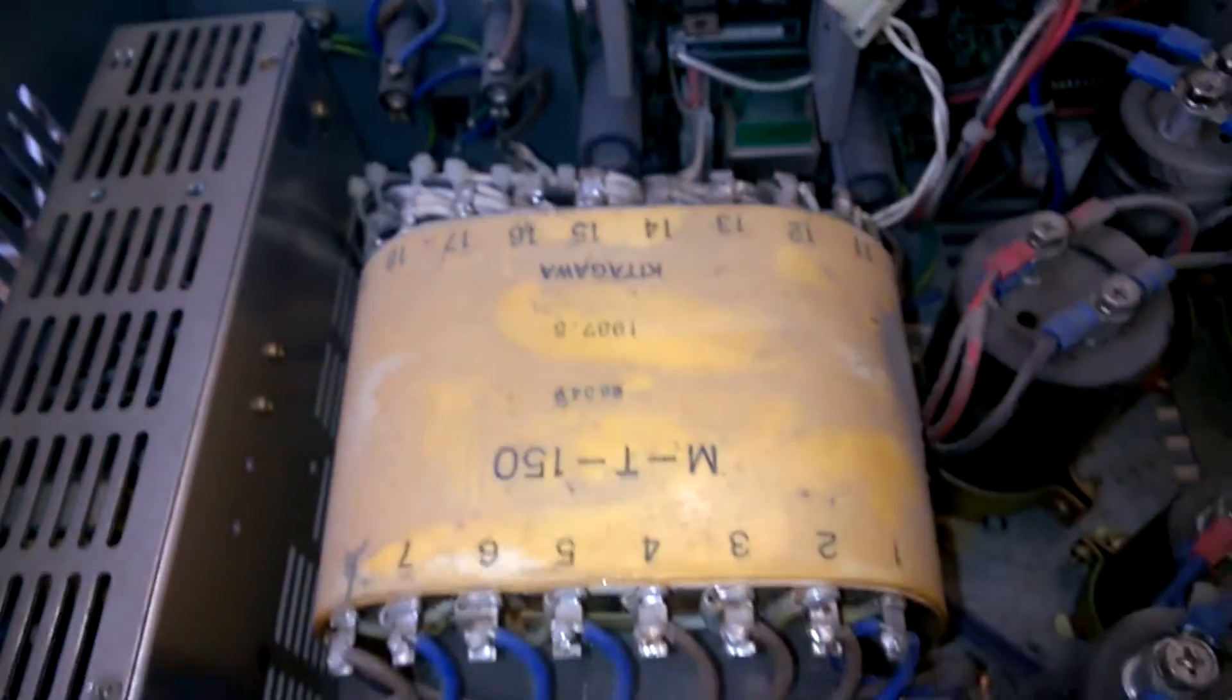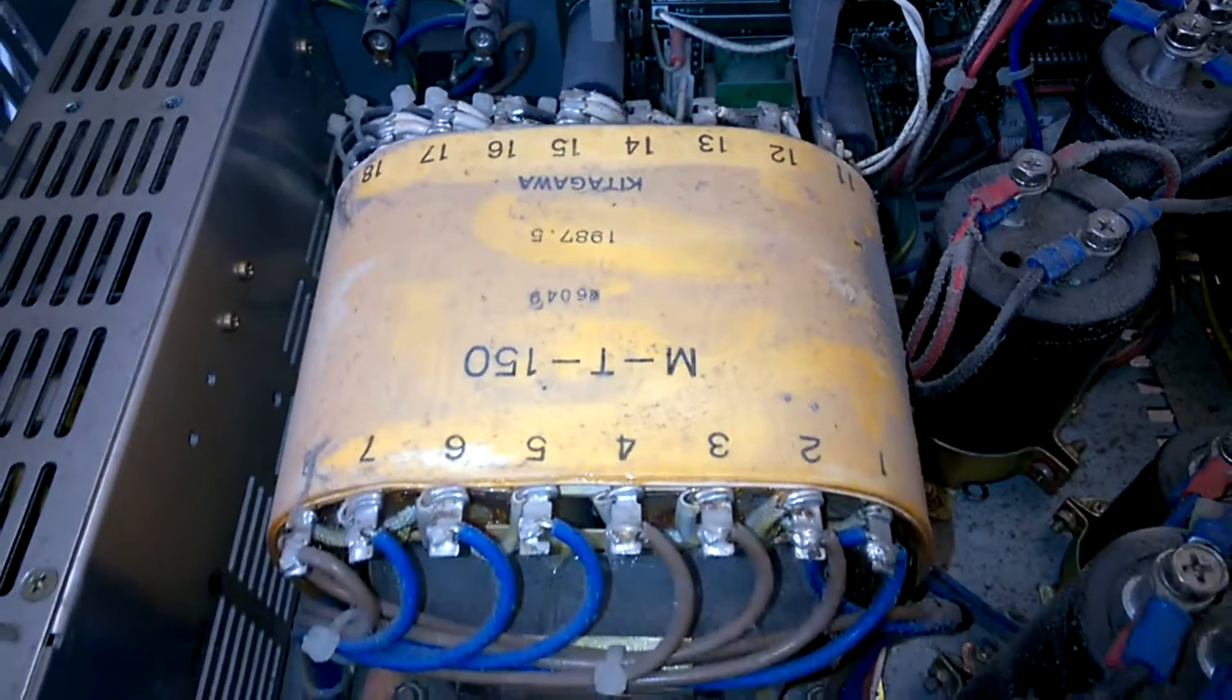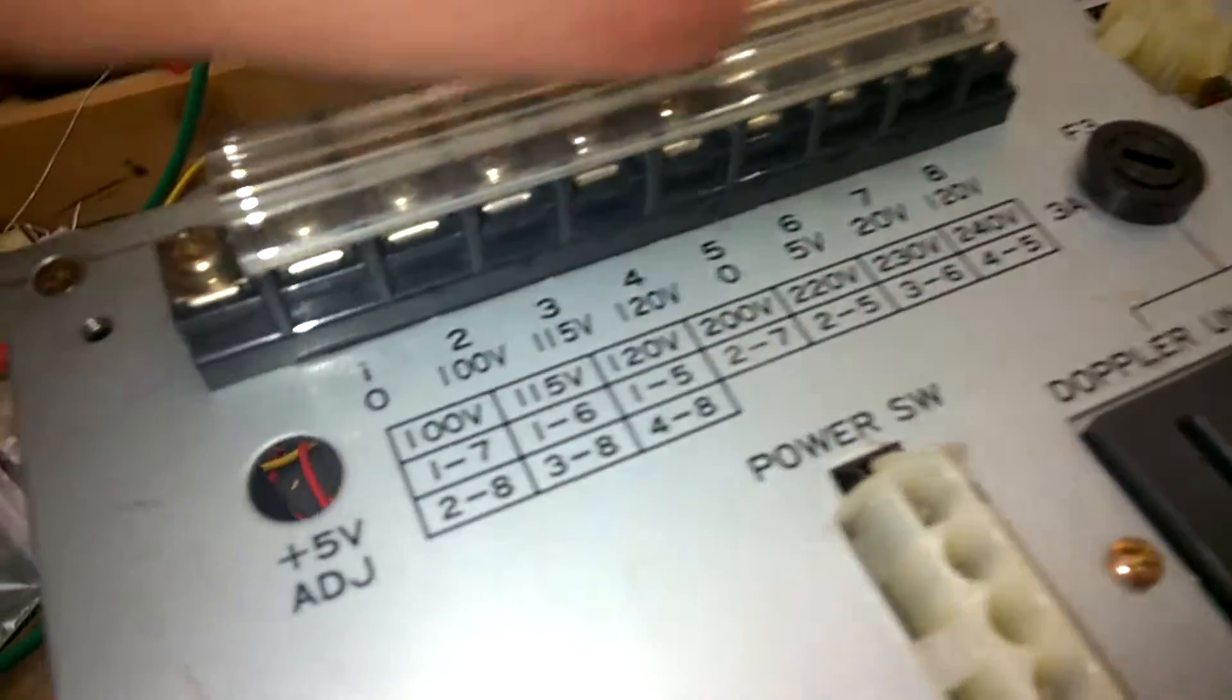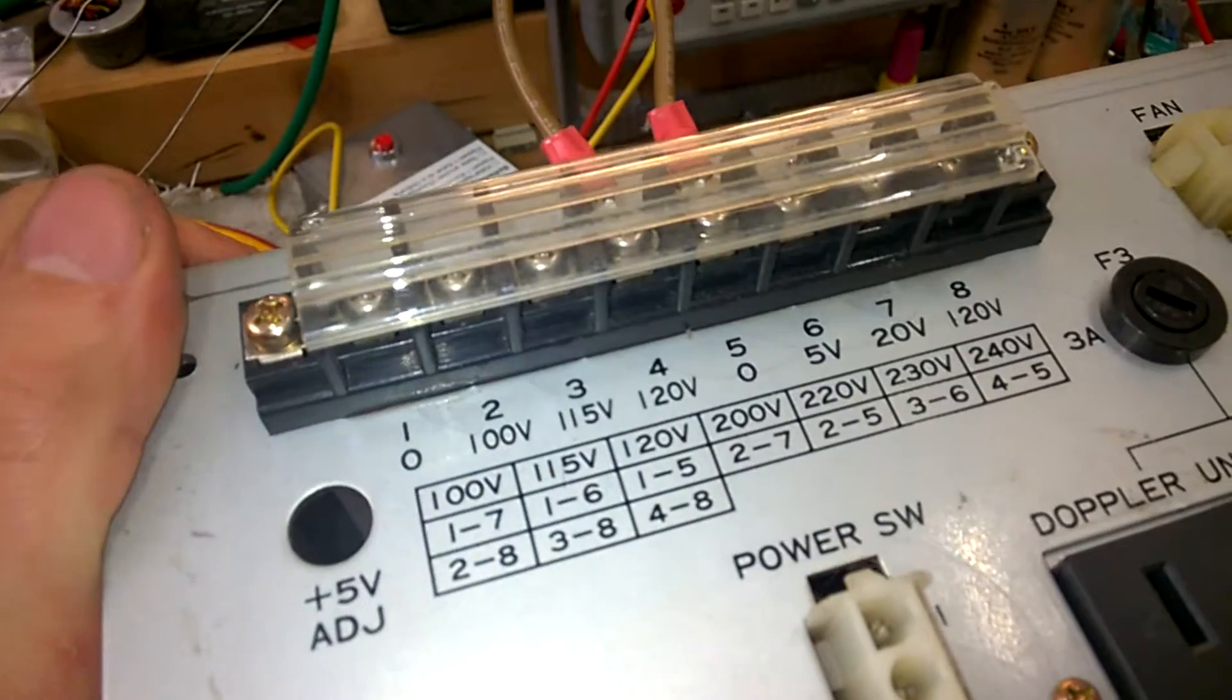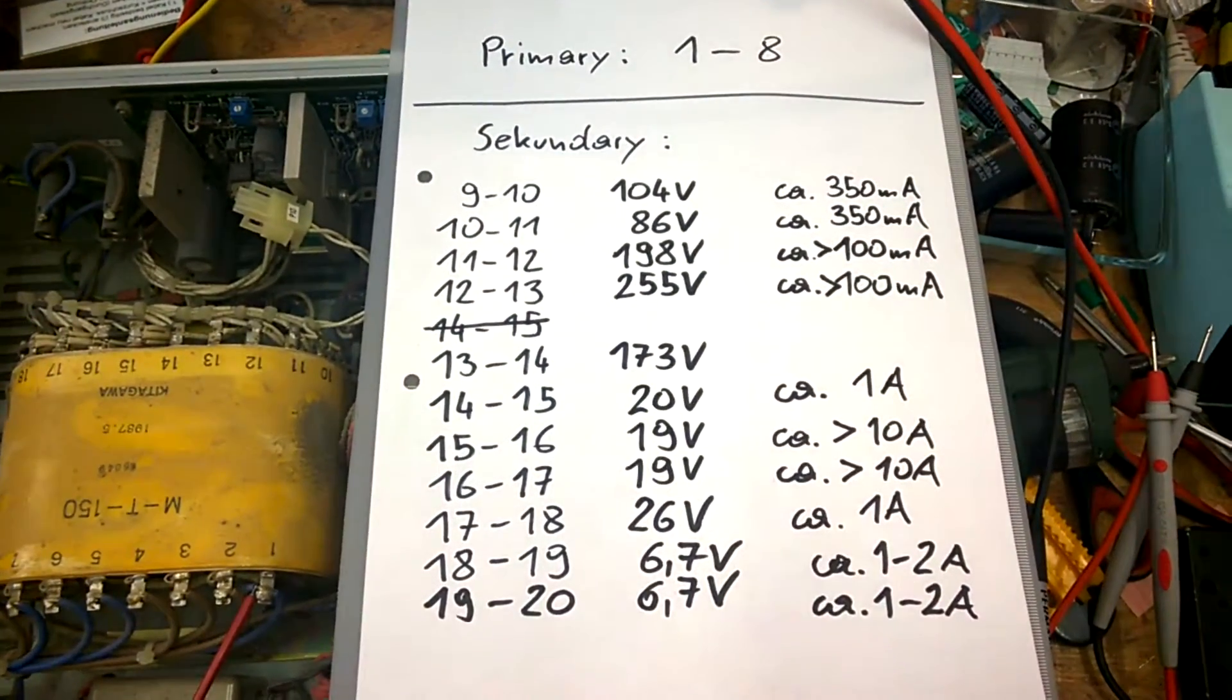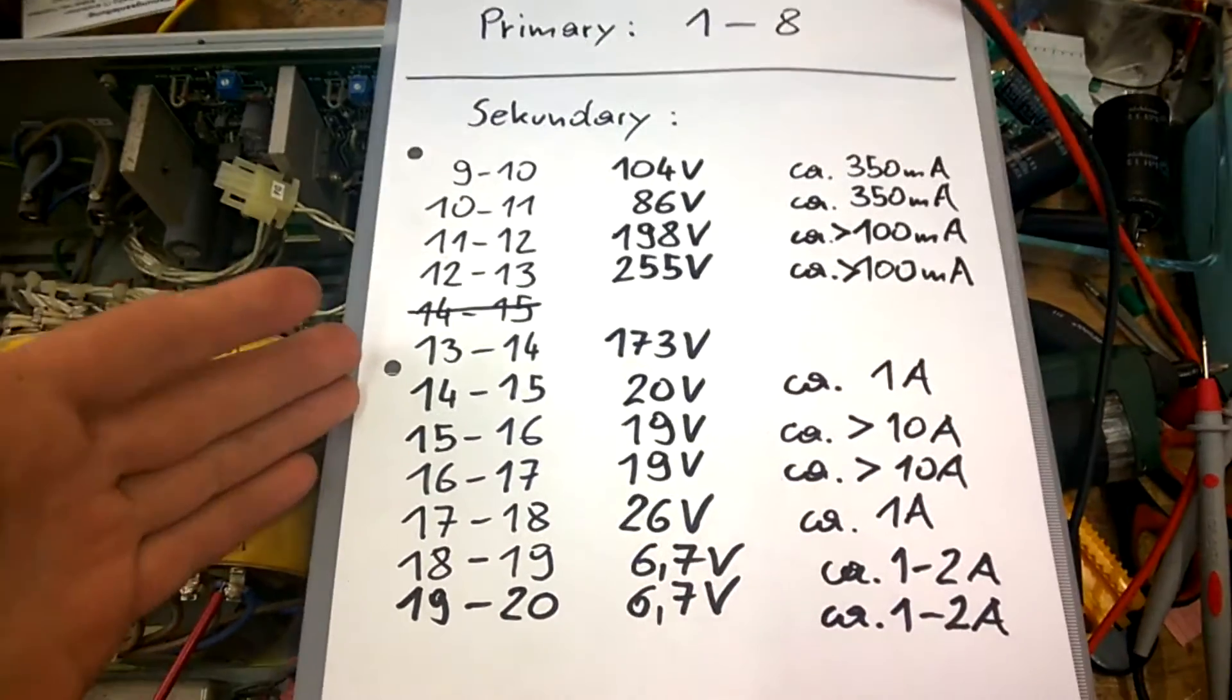I will power it up and see what voltages are here because I want to reuse this power transformer. And when I'm scraping it, I will also keep this thing along with the picture of the connection terminal. This gives a really good power transformer for a tube amplifier.